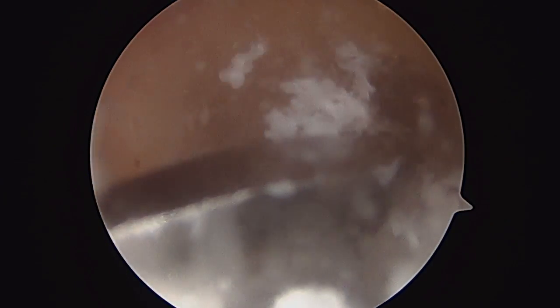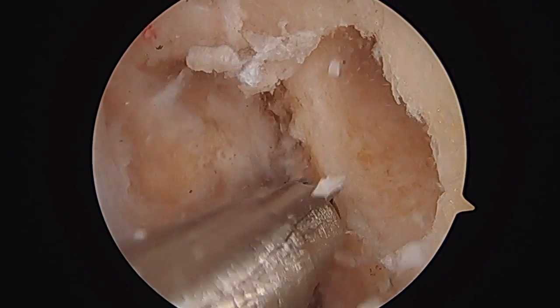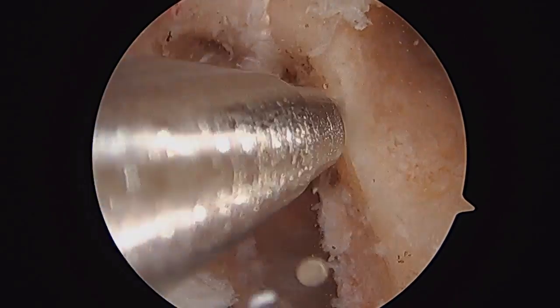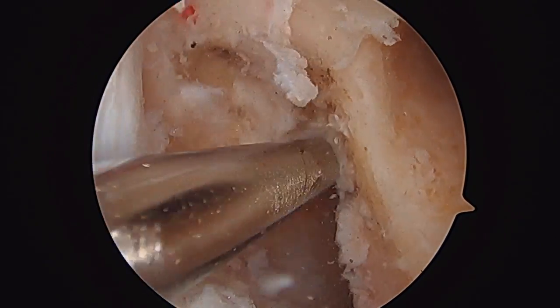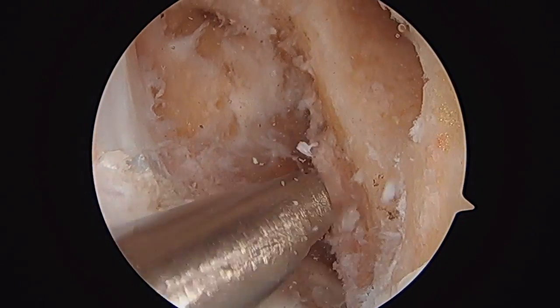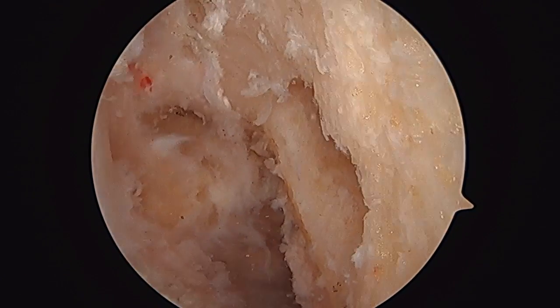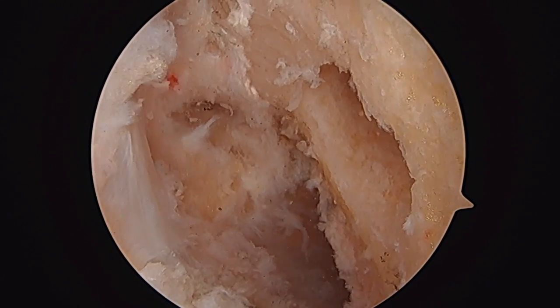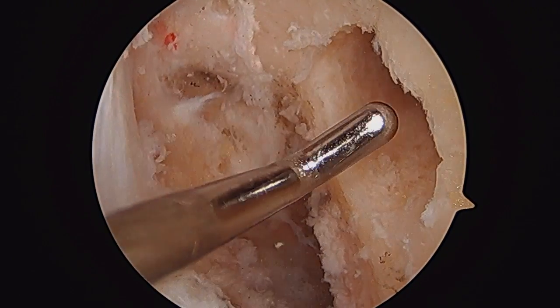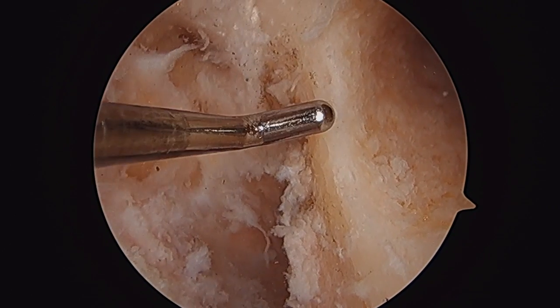So we make the final drilling of our femoral ACL tunnel, and taking the knee out of flexion, you can see we've got about a 2 millimeter back wall, which is what I was shooting for. I've kept the placement of the tunnel behind where our original guide pin was placed. This has been sequential asymmetric drilling posteriorly and inferiorly. And again, I like the back wall here, about 2 millimeters.